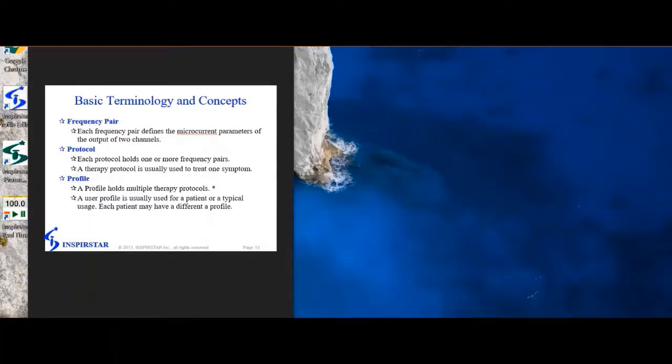This video will walk you through the process of how to create a profile and edit a profile. First, let's repeat three fundamental terminologies: frequency pair, protocol, and profile.